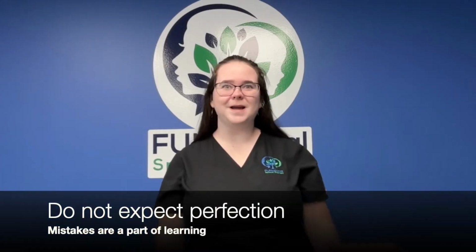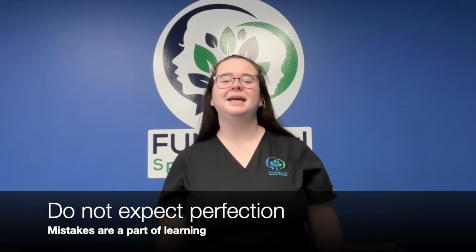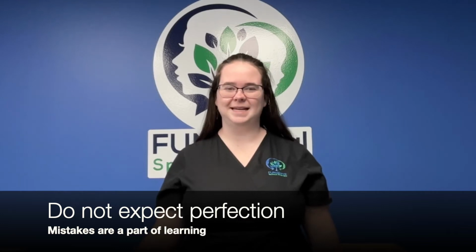Tip 4, do not expect perfection from yourself. Hitting the wrong button is part of using AAC. Model that errors are a part of navigating the device. So is having to hunt for buttons, especially at the beginning.